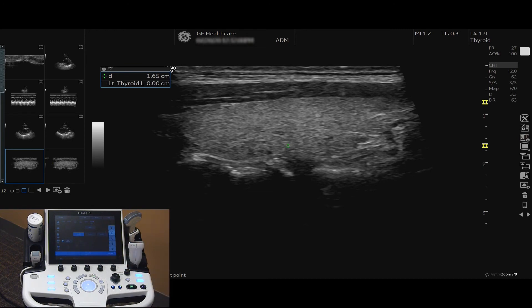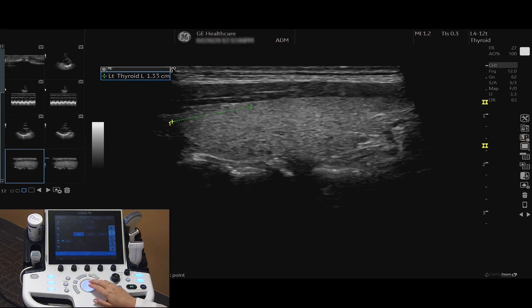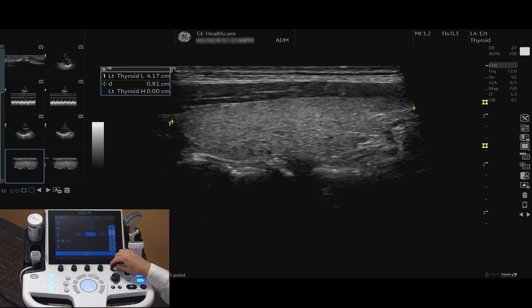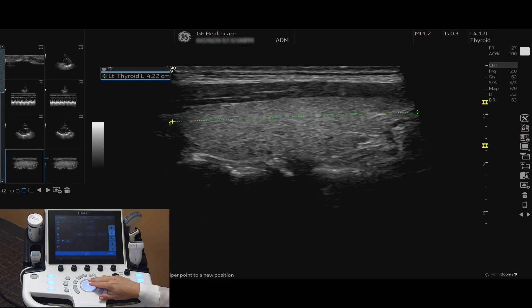Use your trackball to move the caliper to your first location. Press Set. Drag the second caliper to the desired location. Press Set. The measurement will be displayed in the measurement box. If you would like to change the position of the caliper, tap Cursor Select and turn the rotary button. This will allow you to toggle between the displayed calipers. Use your trackball to move the caliper to its new location.